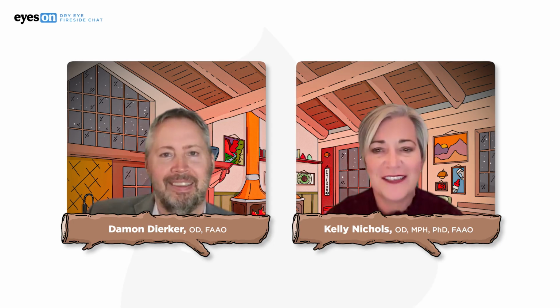So is using fluorescein as part of a comprehensive eye exam something we should be embracing, or is it really just for the dry eye or ocular surface disease exam? I'm a purist, so I'd like to say that it's involved in a routine eye exam, so that you can decide whether there's something that's worrying you or a trigger enough for them to come back for an ocular surface exam.